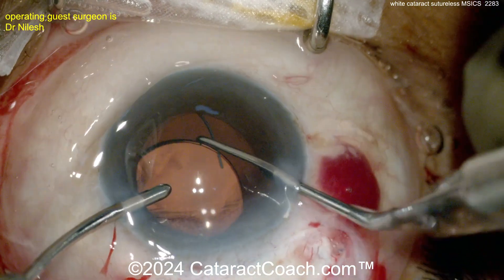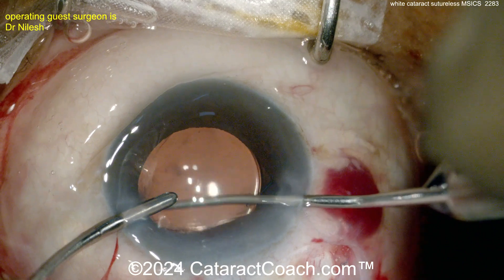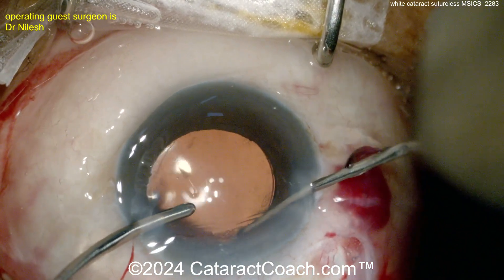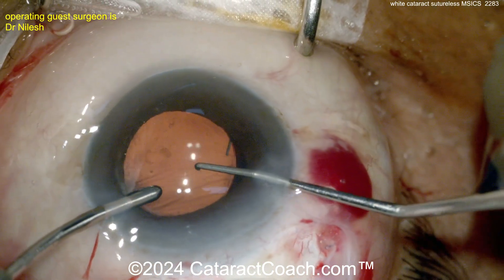This is a great procedure for a patient with a weak corneal endothelium. The beauty here is that you're not using any phaco power at all, even if it's a brunescent, rock-hard cataract.